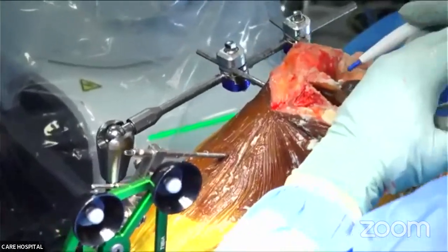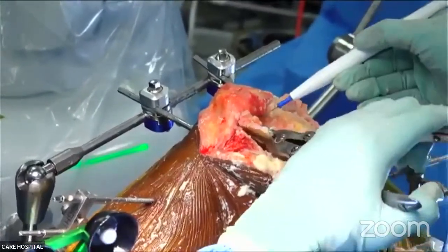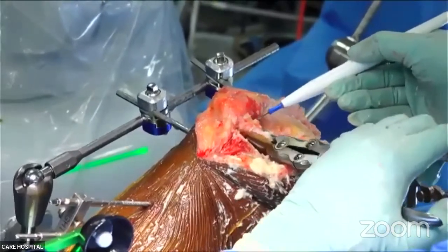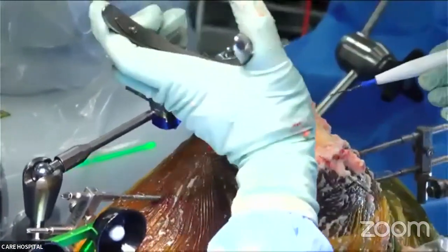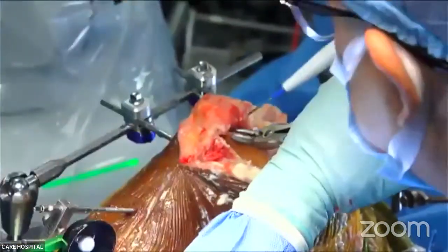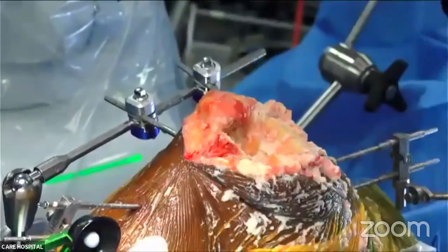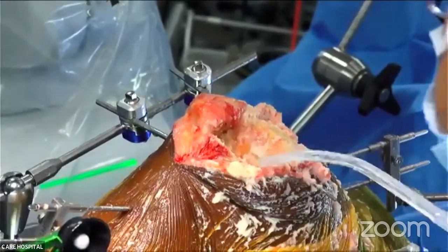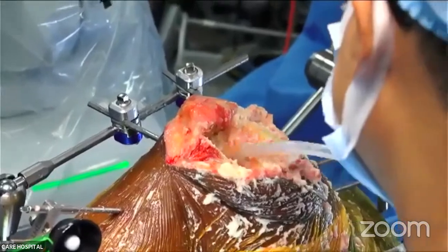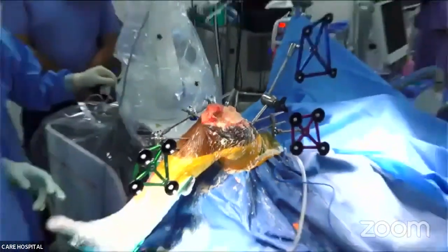Now it will be easier to take the femoral cut, the remaining cut. Suction. So we go back to the femoral cut now.